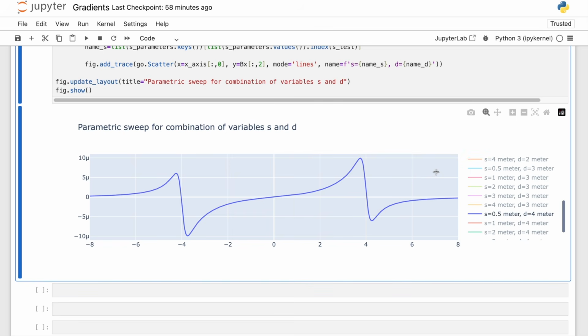So for example, here we saw that 0.5 meter for S and 4 meter for D gave the strongest maximum field. But again, here we have some linearity issues which will need to be solved in the future.